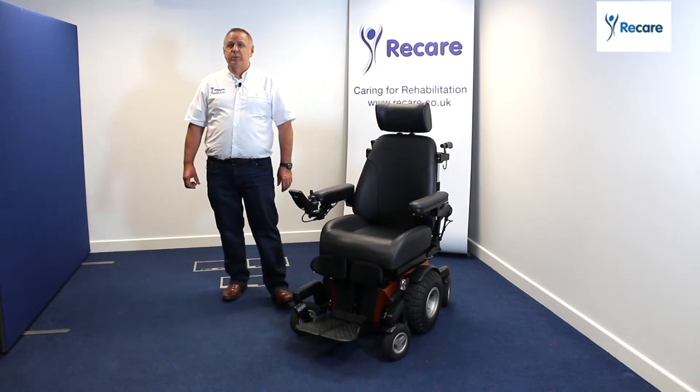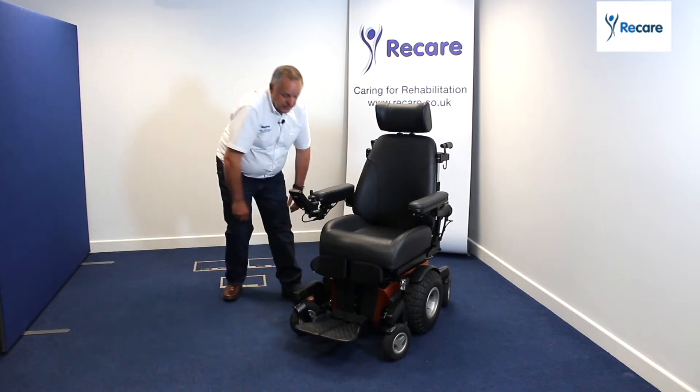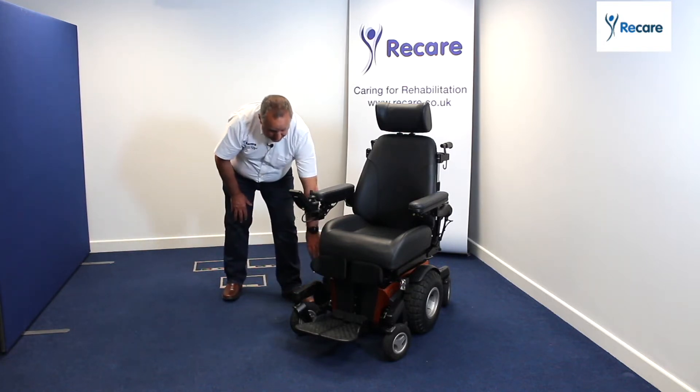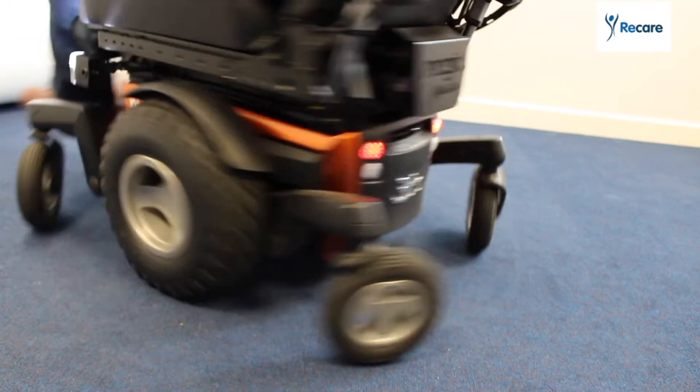The chair itself is a highly adaptable base. What I mean by that is you've got the base unit here which allows us to change the wheels on the side, so we can have normal day wheels or off-road wheels to give us more functionality when going across country.